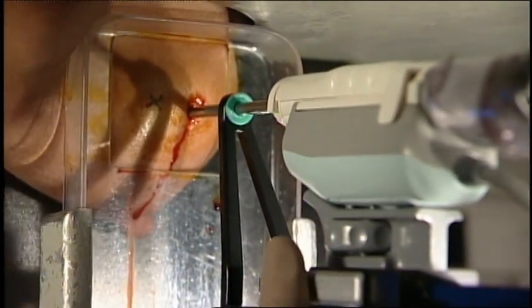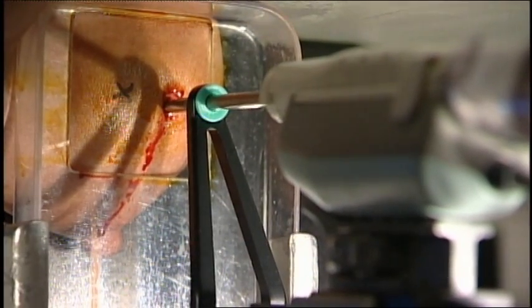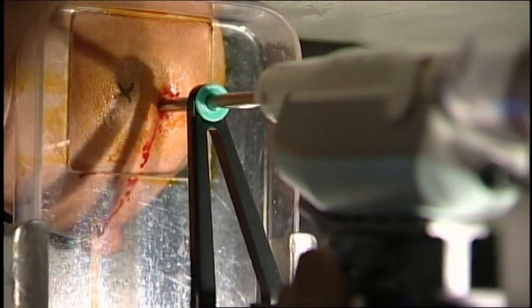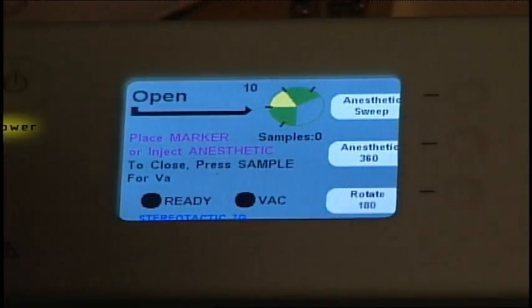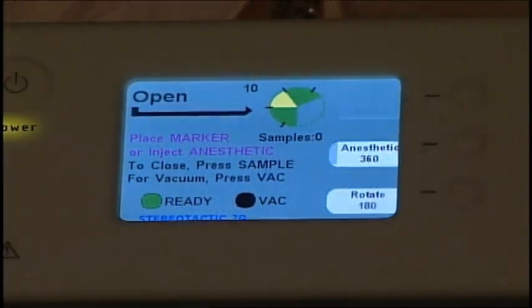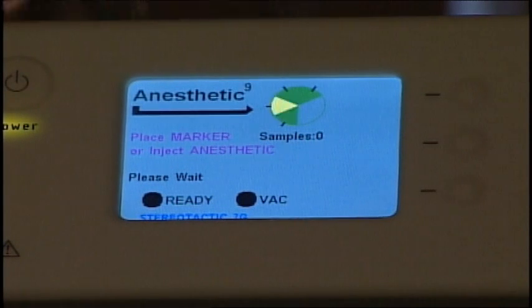Once we've made our skin incision, we can advance the Encore Probe into the Z-depth identified at the targeting, and then we'll take a stereo pair of images to document we're in the proper location. Once we've identified our appropriate location, we'll set our sweep.